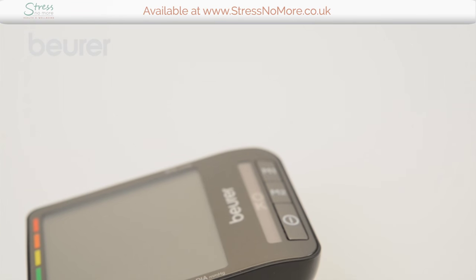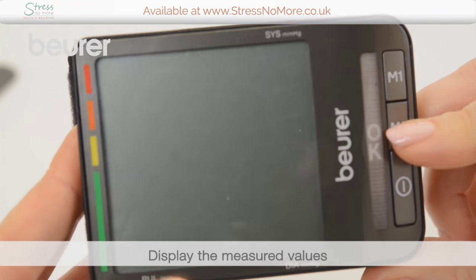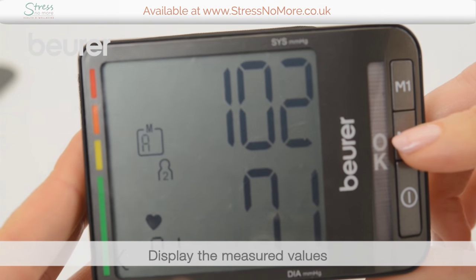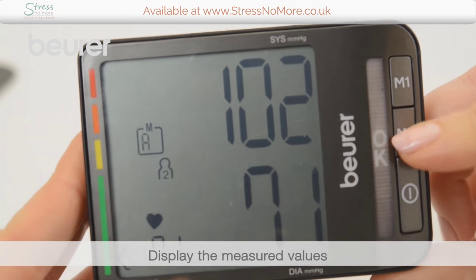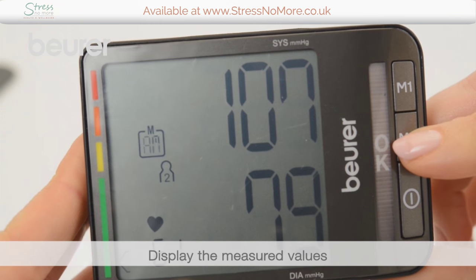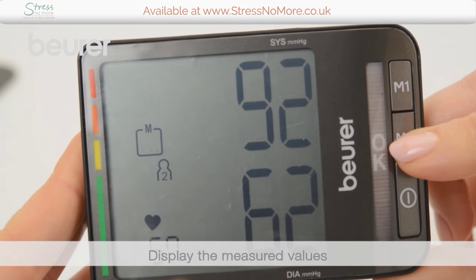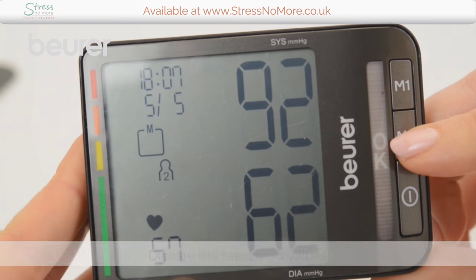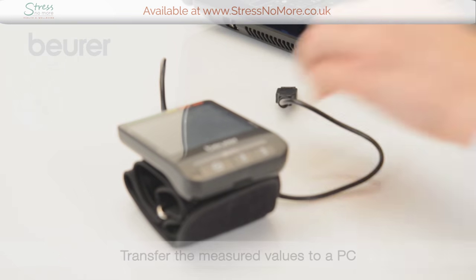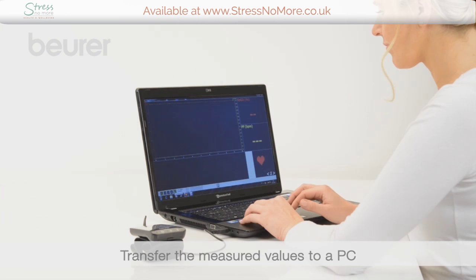Display and delete measured values. Select the user memory by pressing M1 or M2. Confirm the selection using the same button. The average value of all stored measurement values appears. By repeatedly pressing the button, average values for morning and evening can be called up, as well as other individual values. The values can also be transferred to your PC using the USB cable.